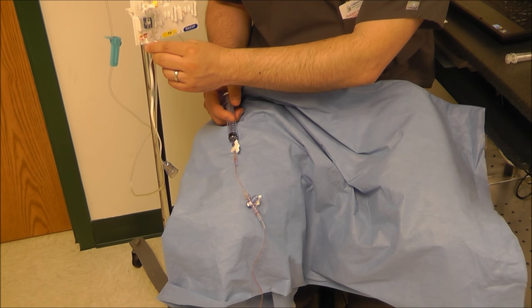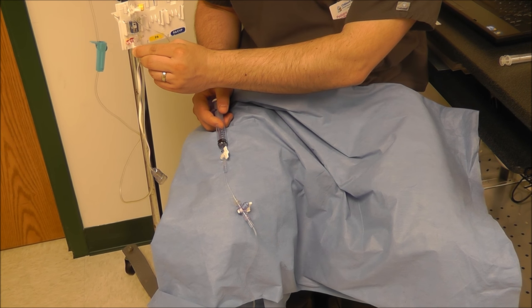Once that's there, we can go ahead and flush with the transducer.